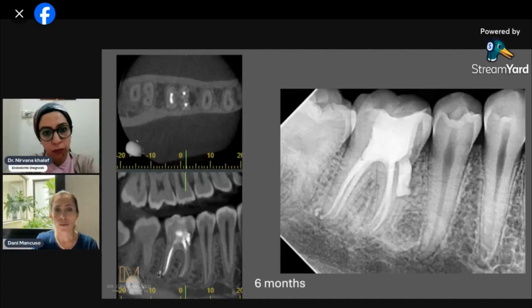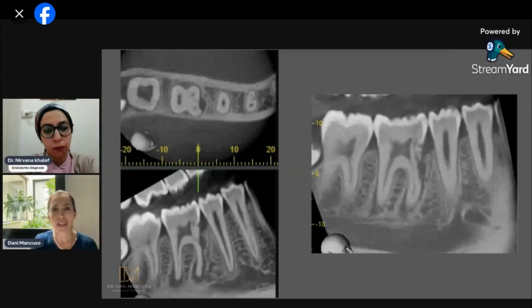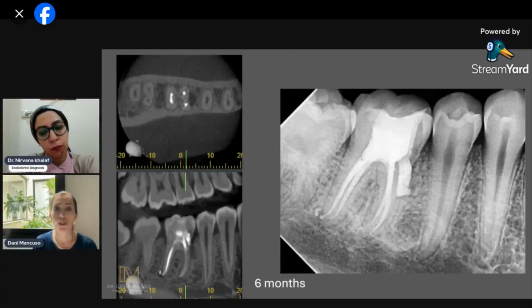After 6 months, we took another scan because there was a little bit of a problem interdentally. The cortical bone is intact over there, and it's just over here. So we tried a little bit thicker, removing. Remember, we had to go through all those lines here. We had to pretty much reconstruct that tooth in bioceramic. And now we are just waiting, and hopefully it will heal.